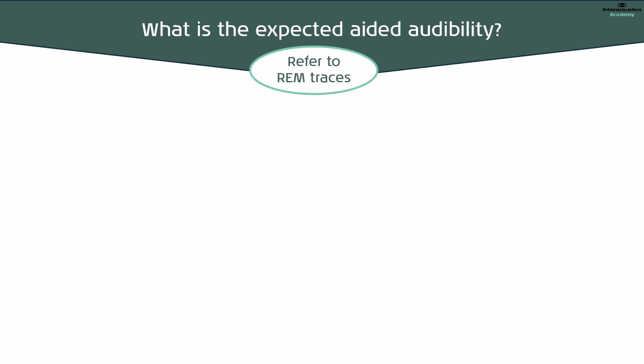From here, we can determine which stimuli are likely to be audible at which levels, and then start our testing based on that information. If the hearing aid output is less than 10 dB above threshold, then it is less likely that an aided cortical response will be elicited.